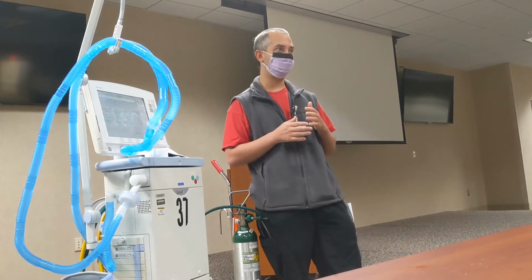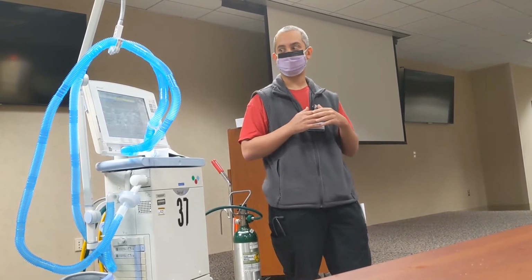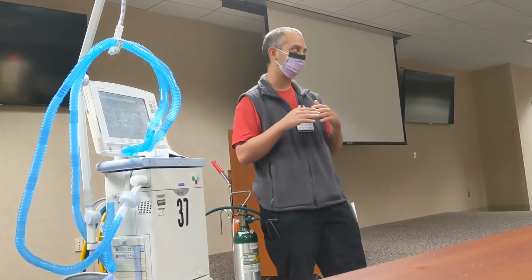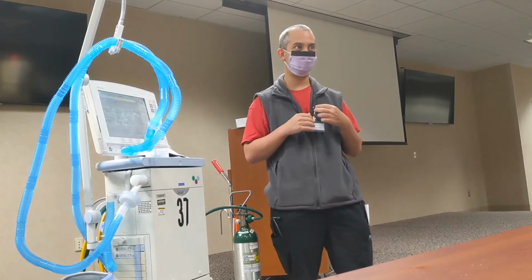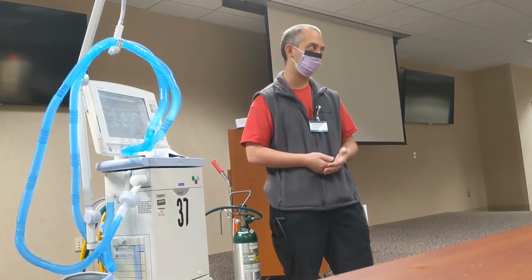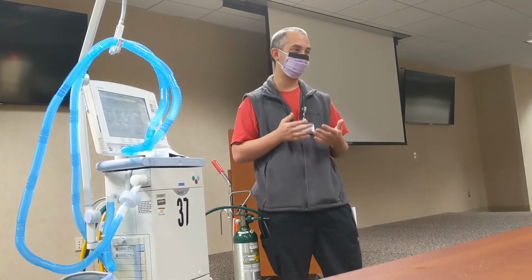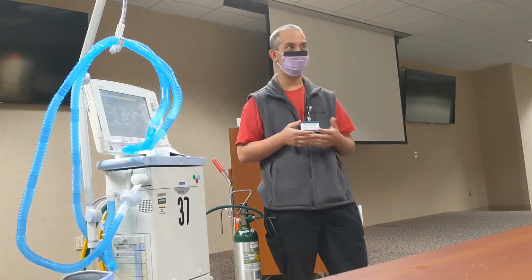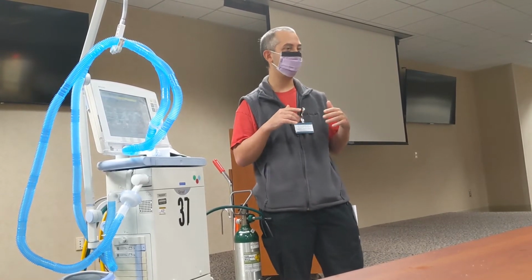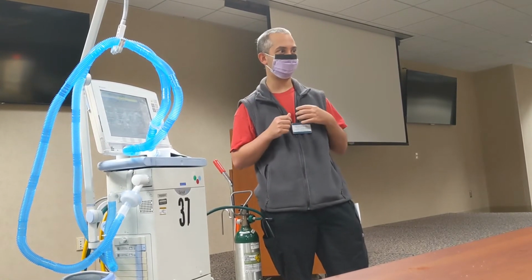I usually start right around 30 because the P high is basically the equivalent of your plateau pressure if you're in a control mode. So when we try and do lung protective strategies for ARDS and even non-ARDS patients, the goal is to keep plateau less than 30. So by setting your P high at 30 right at the very beginning, you're guaranteeing that you fit into lung protective strategies.